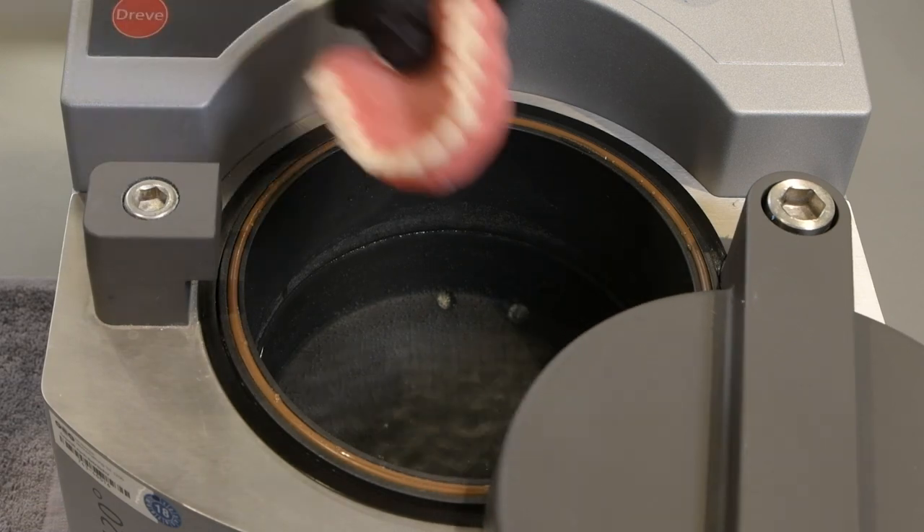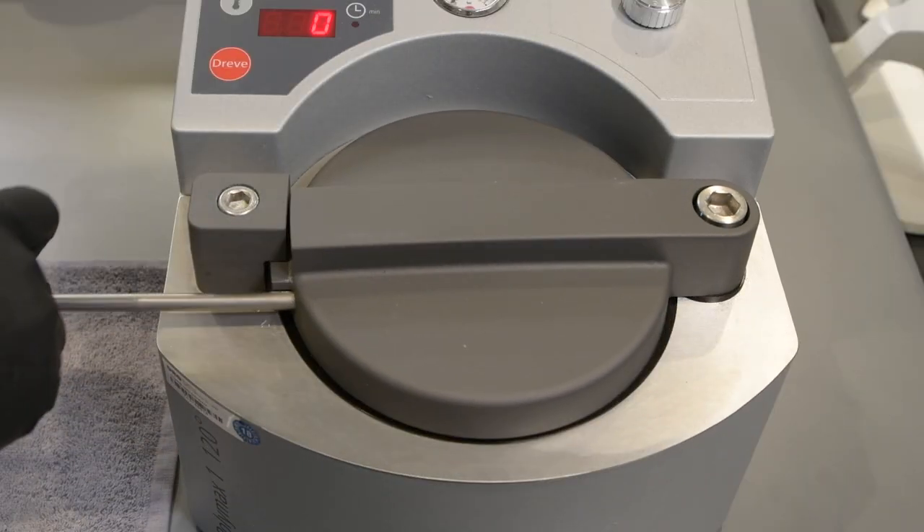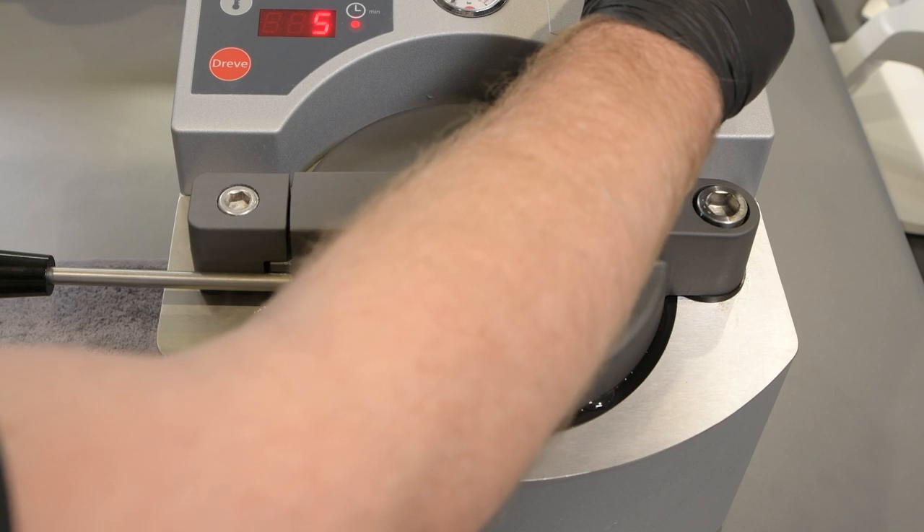Polymerize the denture in a pressure pot at 3 bar of pressure and 45 degrees Celsius for at least 30 minutes.